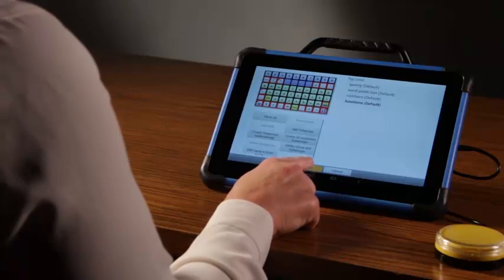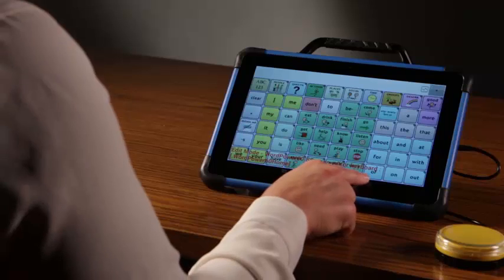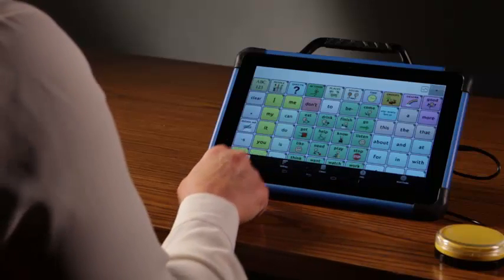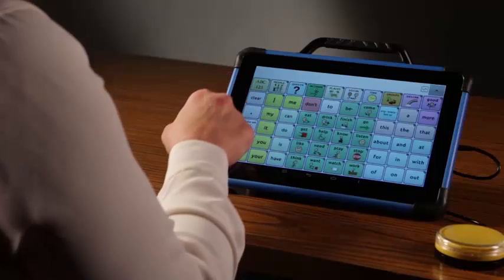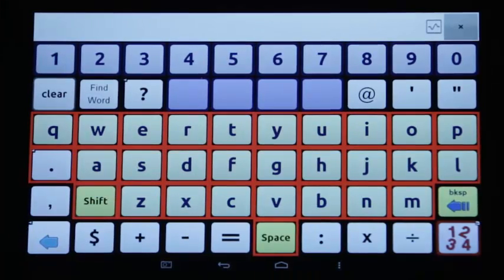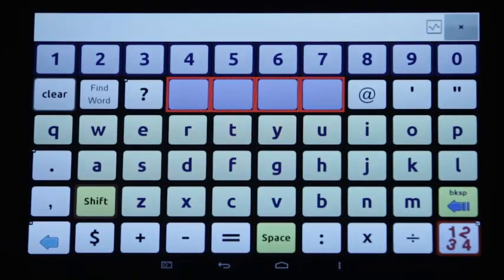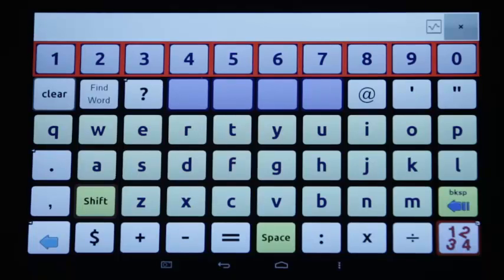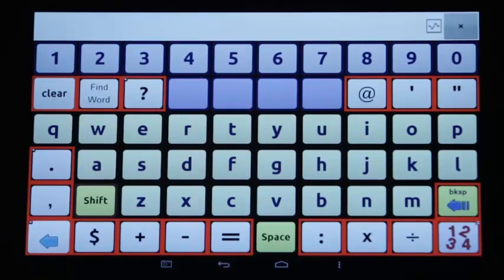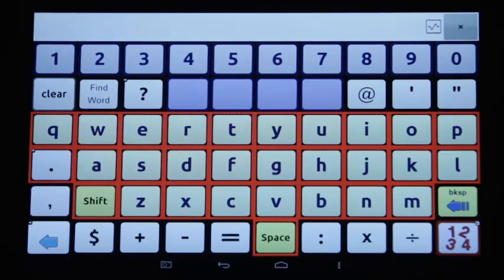Tap Save. Arrow back to the vocabulary. Tap Menu, Edit Mode to toggle out of Edit. Let's look at the scan we set up. QWERTY.